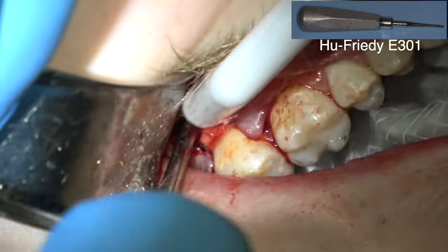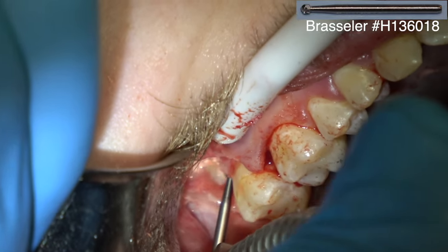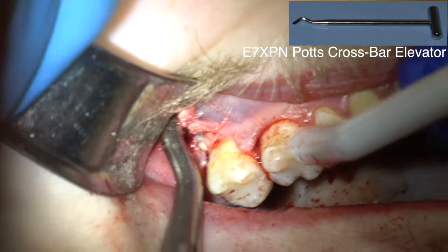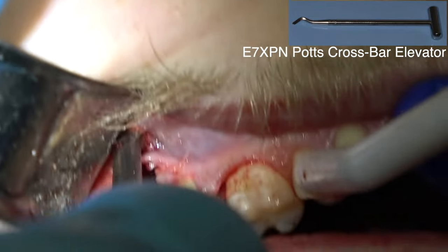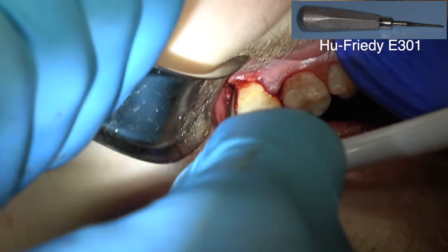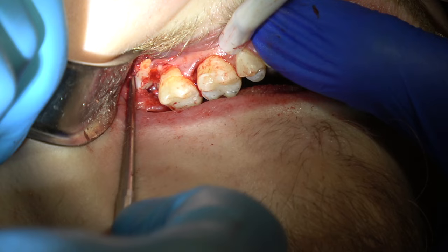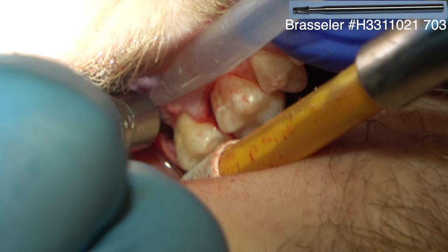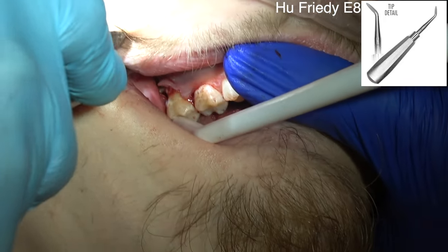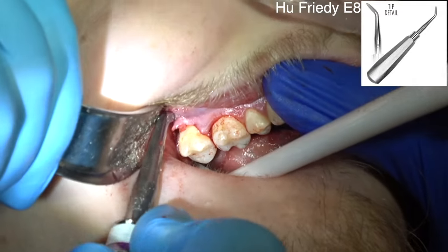Louisa's been with me for 28 years, and Pam has been with me over 40 years — both of them are like having another well-trained dentist working with you. Trying to elevate with the 301. This is a straight handpiece with a 331 bur, trying to make a hole in the wisdom tooth, put the point in there and just elevate it — this instrument has a tip on it and sometimes you can just elevate them out. That bone was just surprisingly dense in the maxillary posterior area; usually it's not that hard.